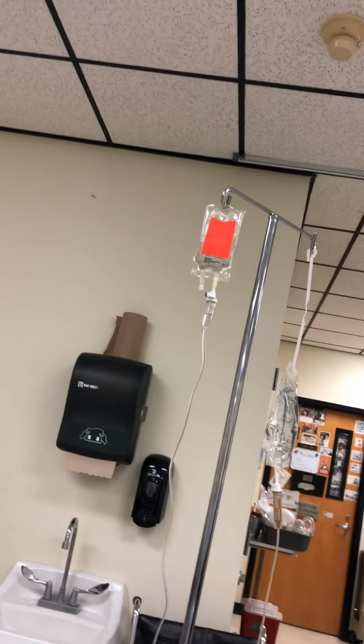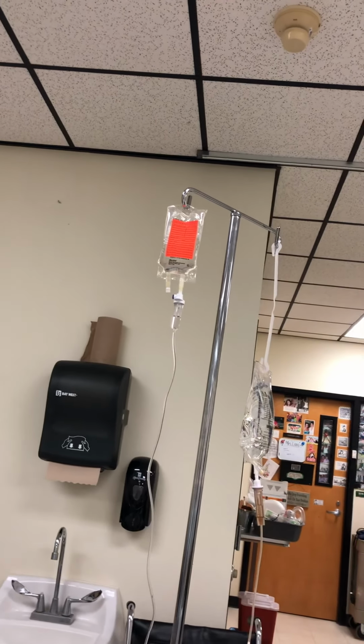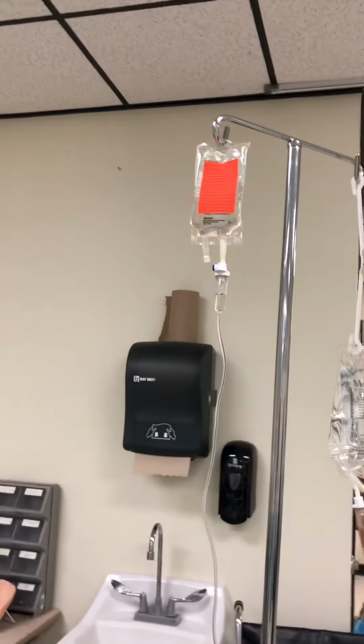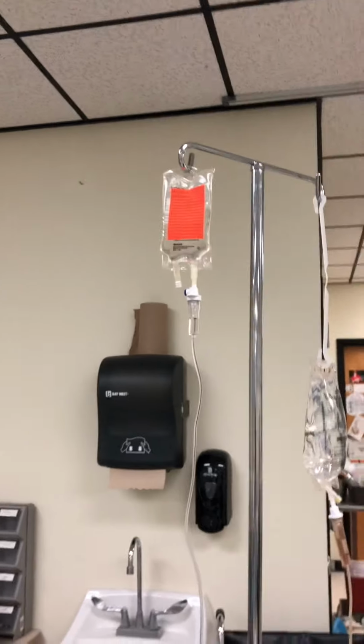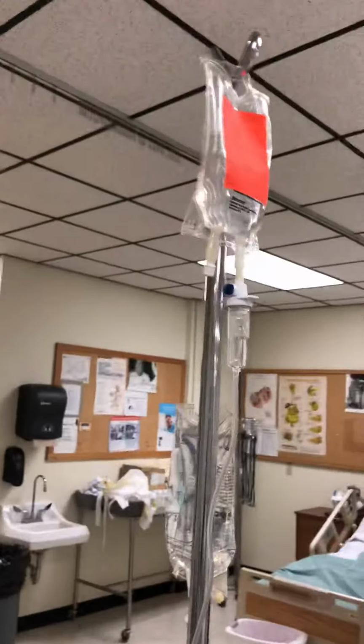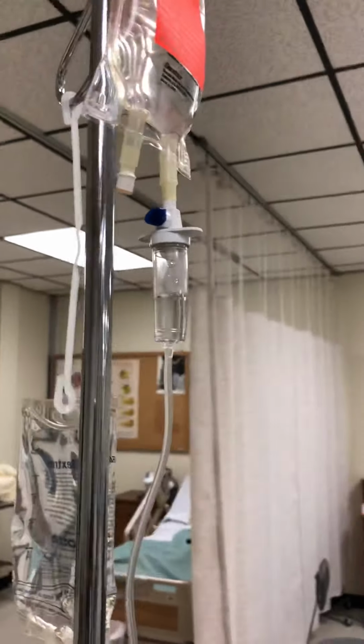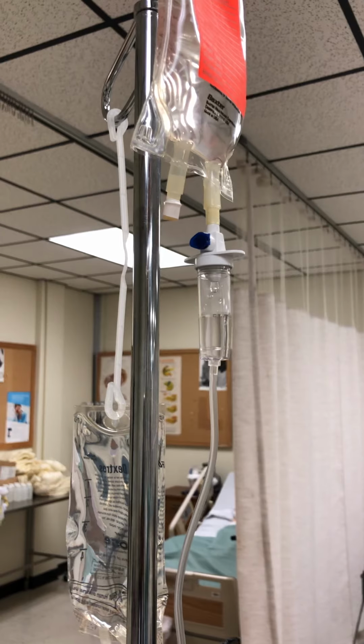We can start counting now. Hold on. Is it zoomed in? On the drop factor. You gotta zoom it in. We're gonna count for 30 seconds. As close as I can get it with the secondary set being at 15. And this should be at 10. So we're gonna start now. Hold on.